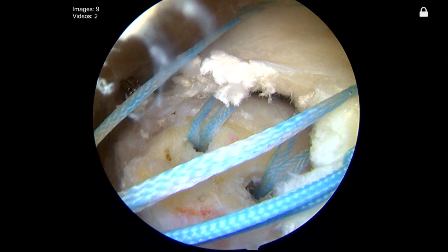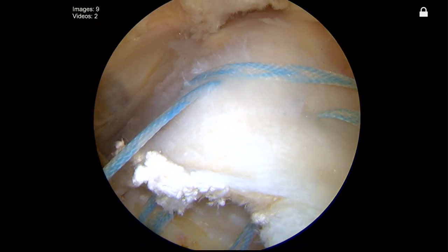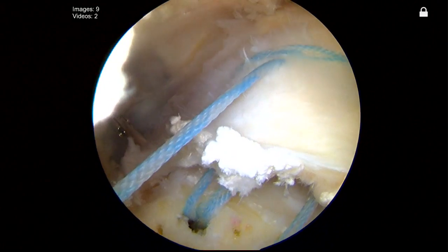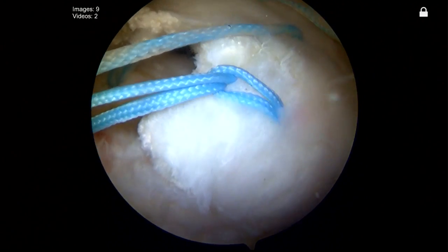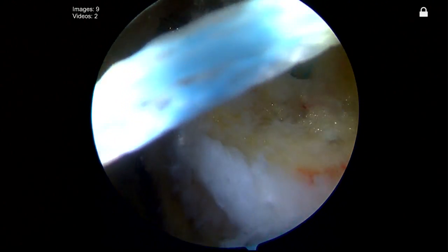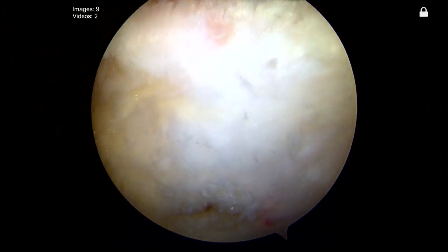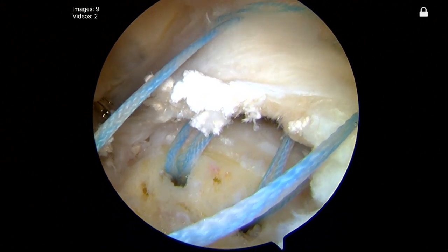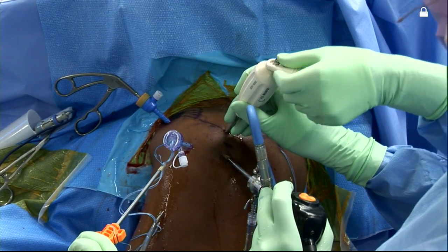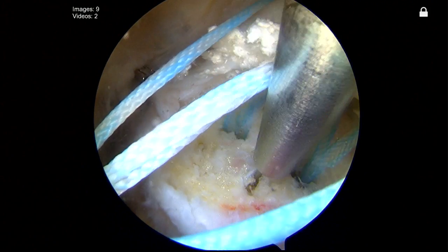Let me reorient us — because we've got a tape spaghetti view here. What we've done at this point is pass our additional anterior two tapes in a mattress configuration. So I have two tapes posteriorly, two tapes anteriorly, and then I brought out one of my anterior tapes and one of my posterior tapes through the lateral portal along with the cinch stitch — these will all eventually end up into our lateral row fixation. You can see we've started to prepare lateral row fixation, coming about 10 millimeters off the edge of the tuberosity. The first thing I'm going to do, Tony, is use this device called a nanofracture — it performs a gentle microfracture within the area of the repair, making very small holes into the tuberosity to facilitate some bleeding into the rotator cuff repair site.